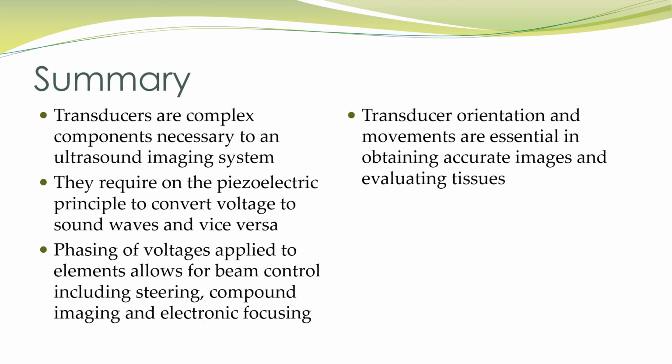So in summary, transducers are complex components necessary to an ultrasound imaging system. In order to visualize anatomy, they require the piezoelectric principle to convert voltage to sound waves and vice versa. Phasing of voltages applied to elements allows our beam control, including steering, compound imaging, and electronic focusing. Transducer orientation and movements are essential in obtaining accurate images and evaluating tissues.